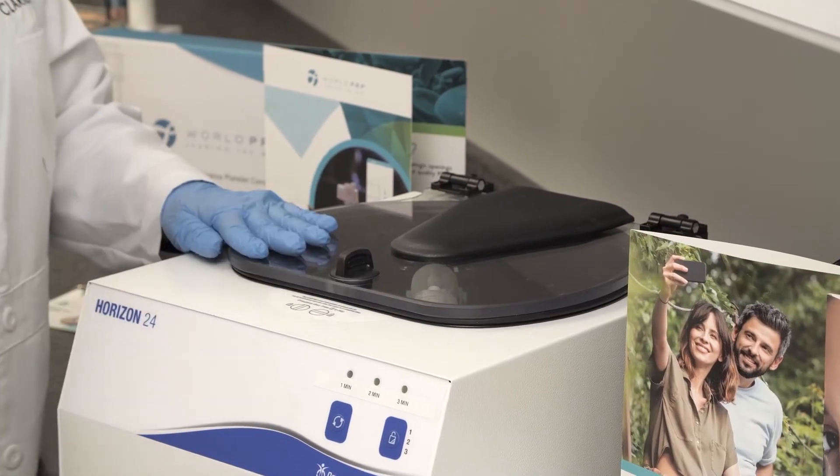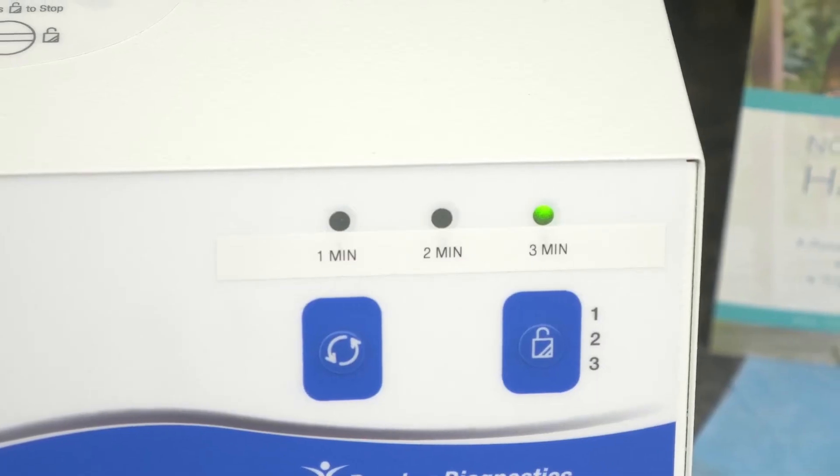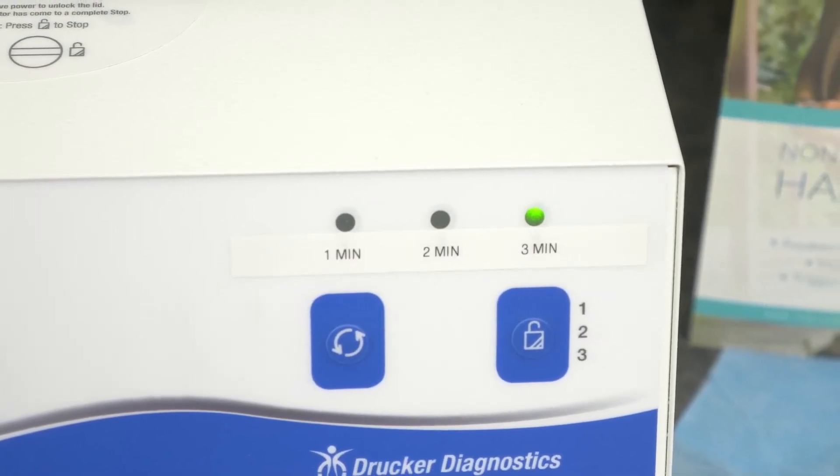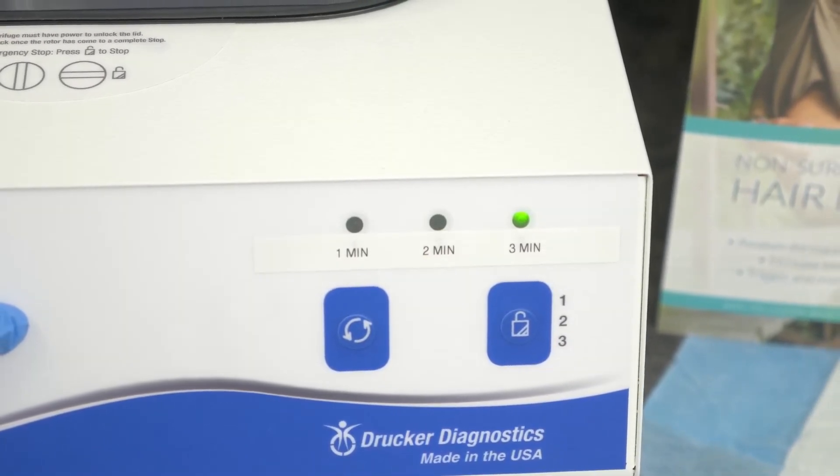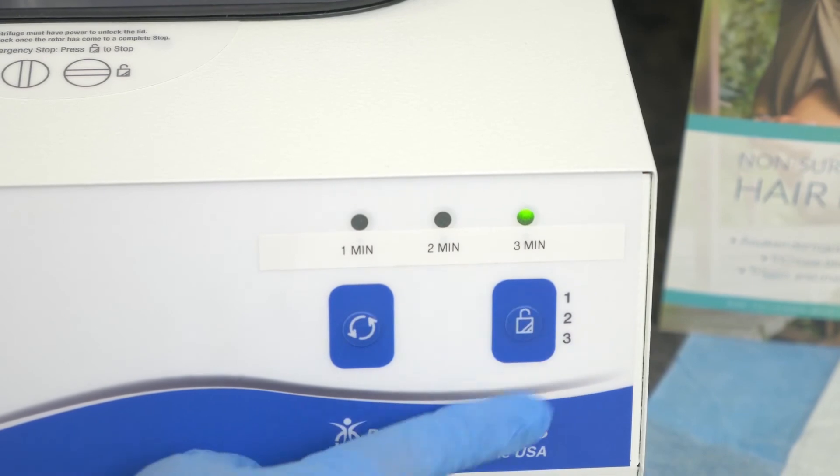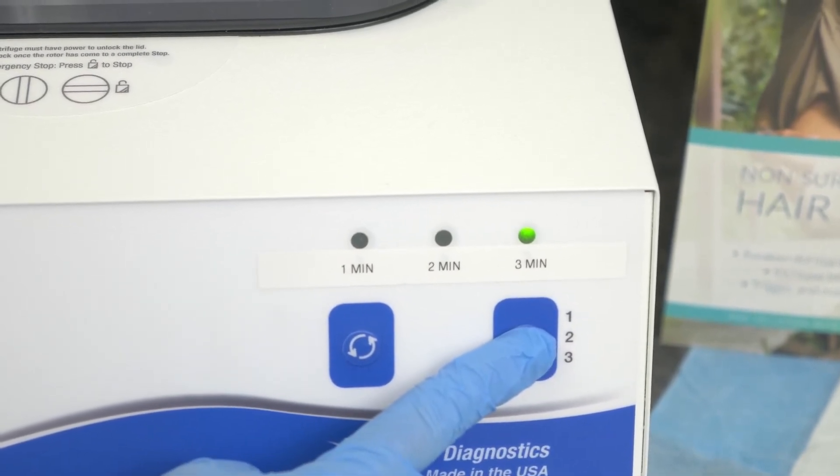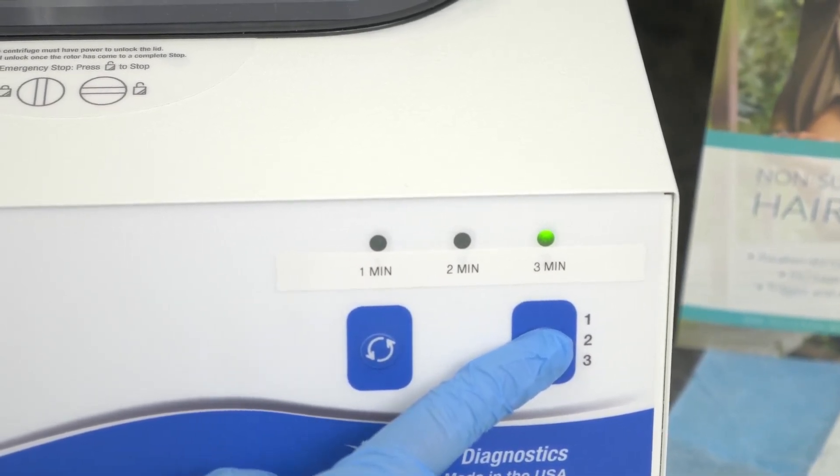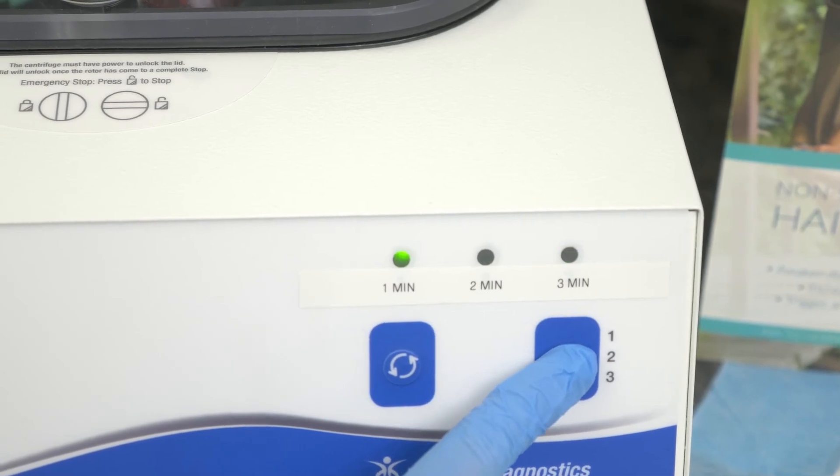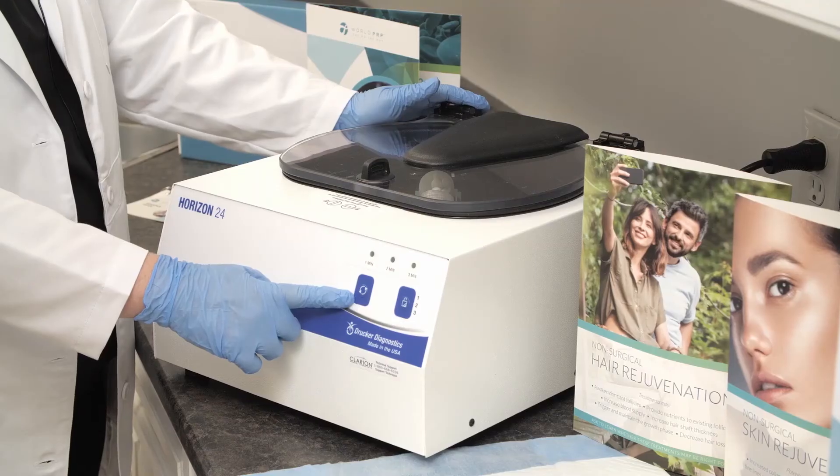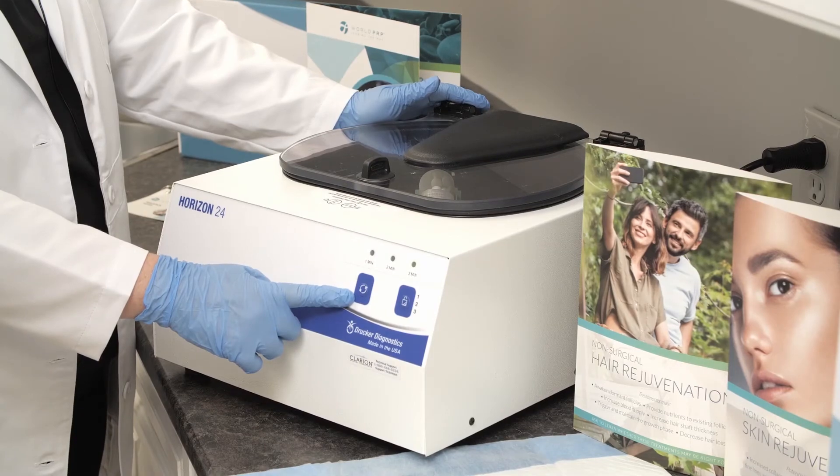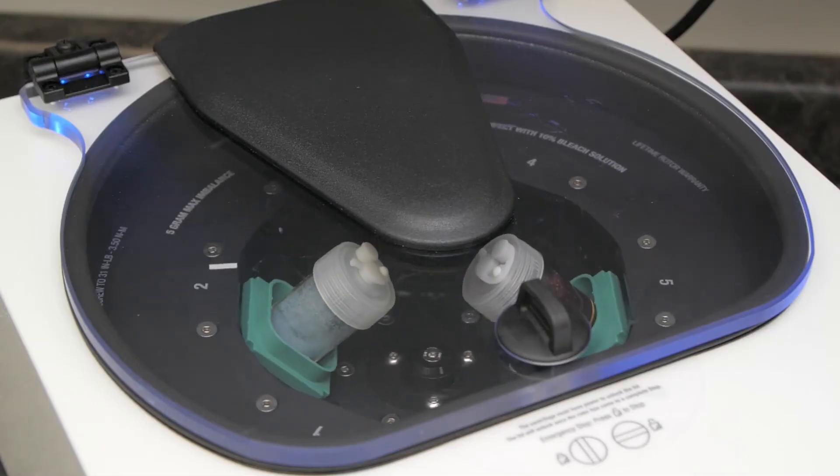On the front of the centrifuge there are 1, 2 and 3 minute spin time options. Select the 3 minute option. This is located above the lock button on the front of the centrifuge. To select this option press the lock button once to lock the centrifuge. Then again until you see the 3 minute option selected. This will be indicated by a green light. Now press the start button on the left hand side and this will begin the spin cycle.